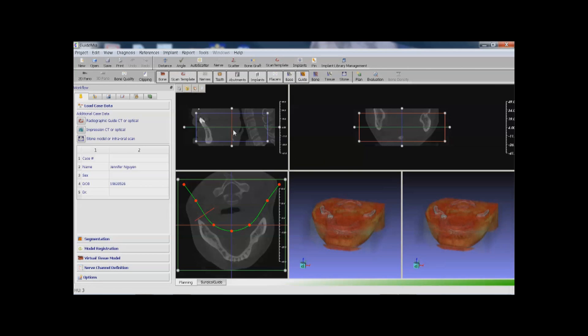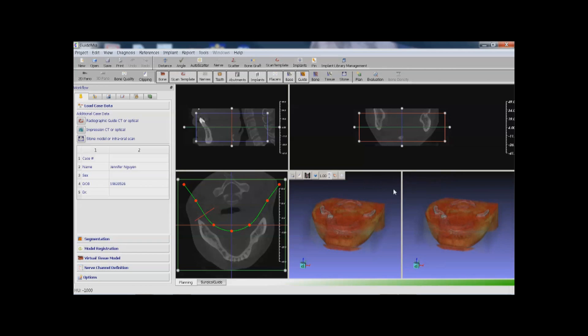GuideMeet has three 2D cross-section views and two 3D views, as well as the task panel. The workflow task panel has tabs including data preparation, implant placement, diagnosis notes, object manager, surgical guide design, and a treatment plan export.